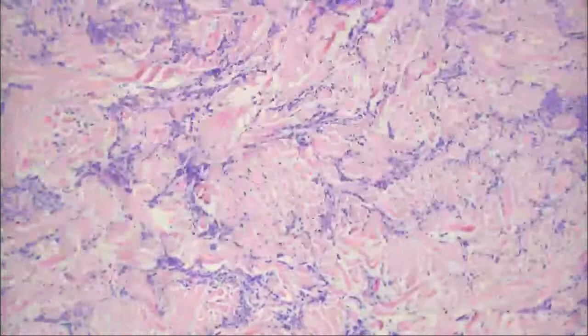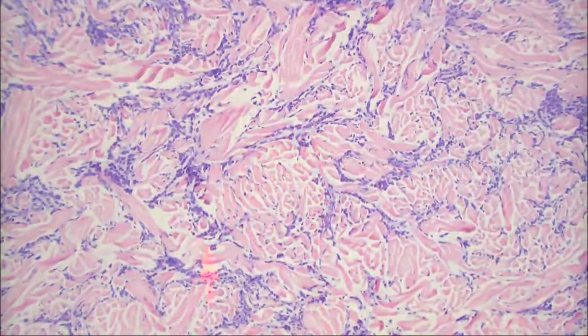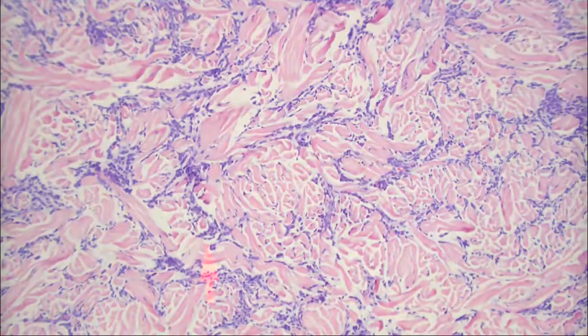When it's in the tissue, I think of lymphoma. What about when you get the interstitial, mostly splayed starburst pattern like this? So I guess that's leukemia. That's far more common with leukemia. Good. So this is leukemia cutis, when you see this pattern.